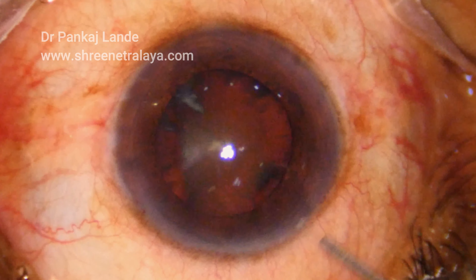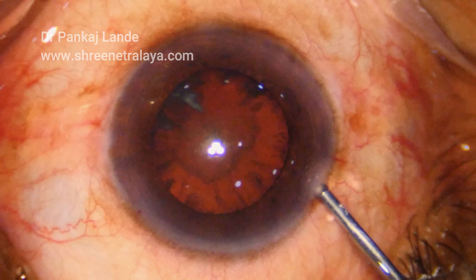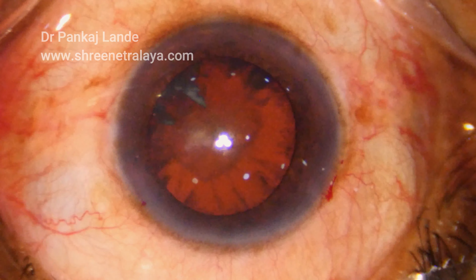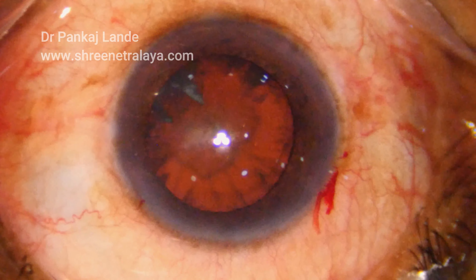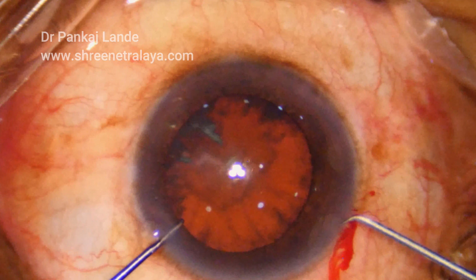To start with the surgery, I have performed a 2.6 mm incision as a main port and a 23 gauge side port. Using a 5.5 mm Rexus marker, CCC is done with a 26 gauge needle.